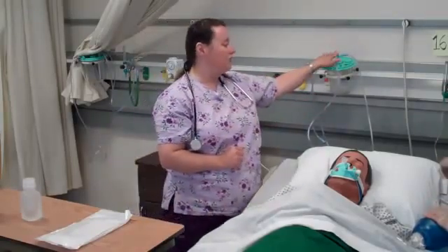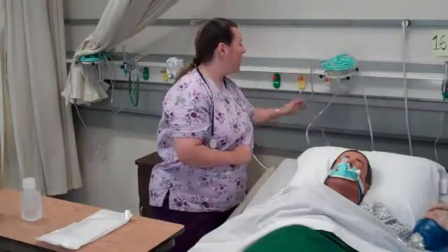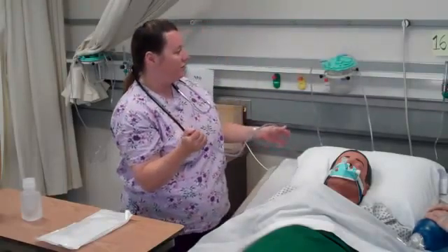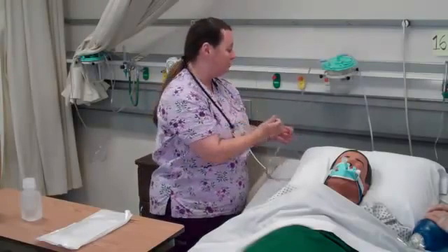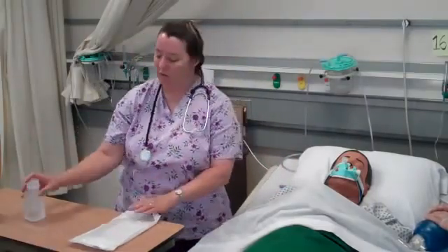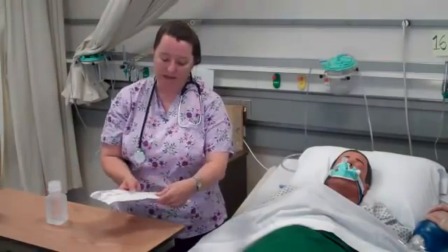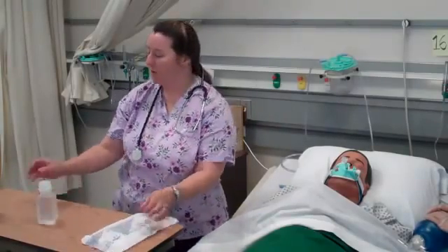I need to make sure my vacuum source is available and working. I'm going to confirm that when I occlude the vacuum tube, pressure does not go above 120 millimeters of mercury. I have that set and ready. I've also made sure that everything is the appropriate sizing and that nothing is expired on my equipment.